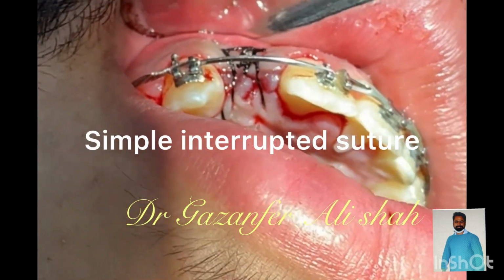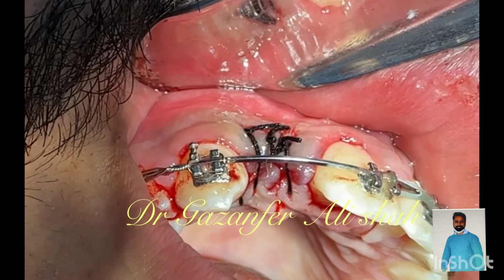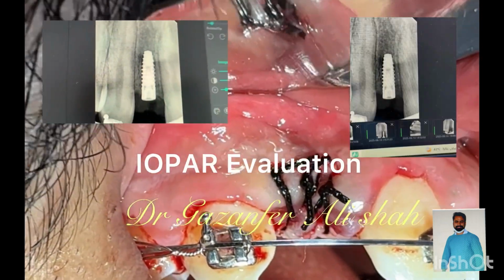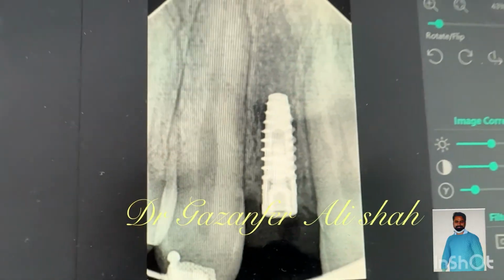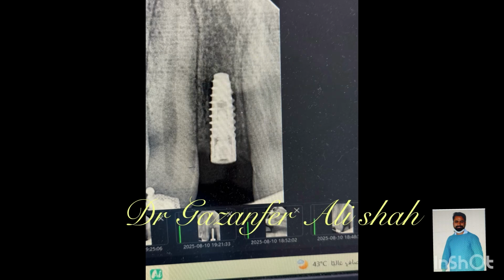We have sutured the flap with simple interrupted sutures to achieve primary closure. You can evaluate closely. And to check its inclination with the adjacent roots, we are taking an IOPA. We will evaluate this patient after 3 to 6 months for the final prosthesis. Thank you.